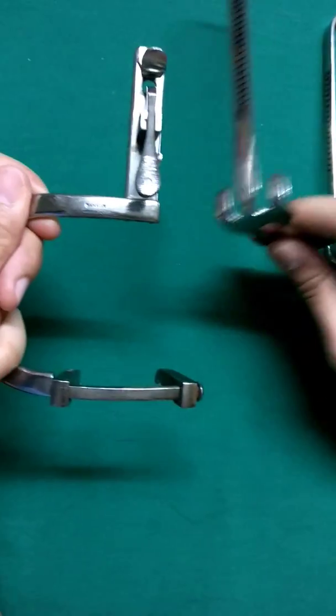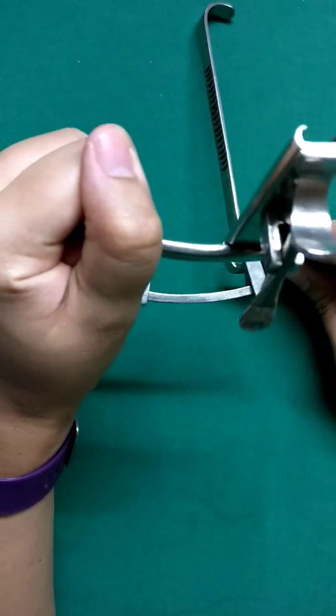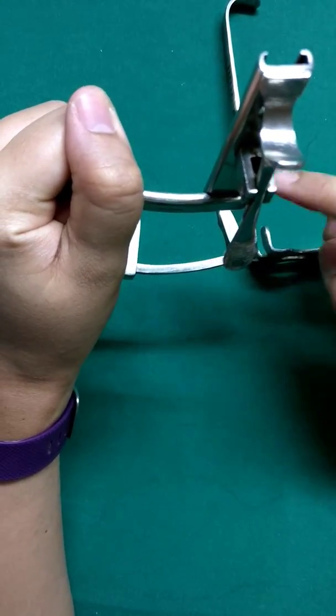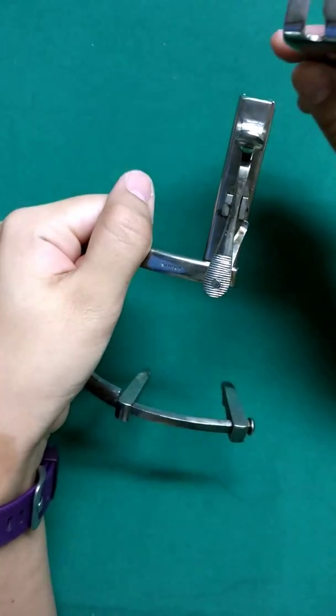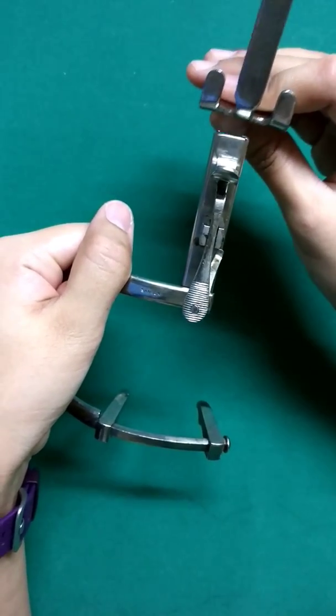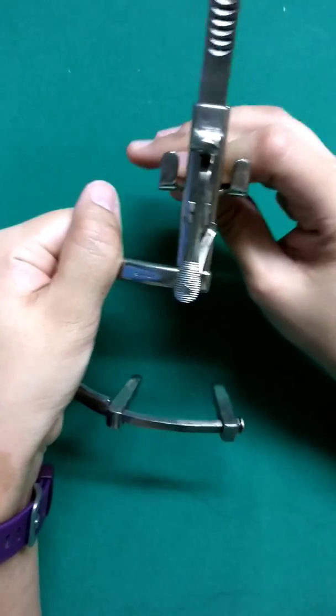The technique of putting this tongue blade is the instrument has to be held like this. This is the open-ended side and the tongue blade has to be put from the posterior region. It has to be fixed over here and slide it in.